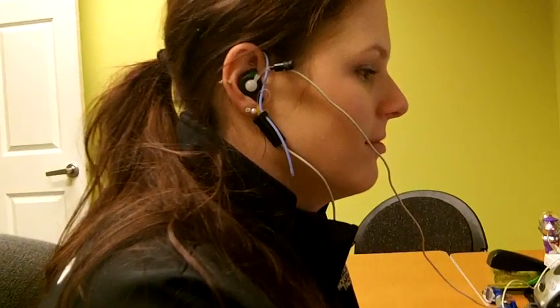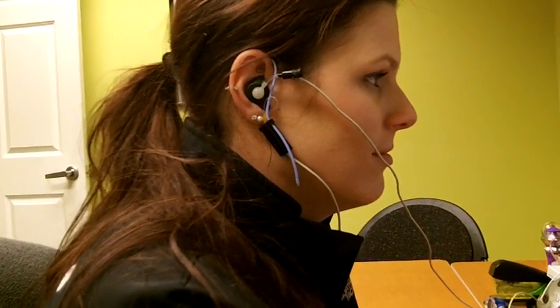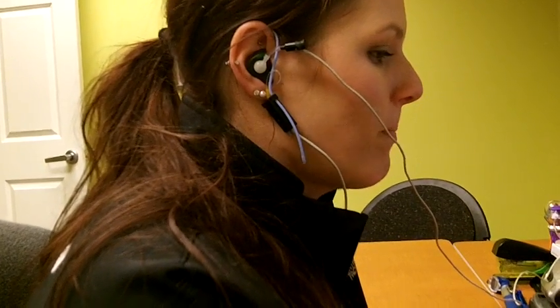Okay, now we're going to show you how to do live Speechmap. So you have just measured your real ear to coupler difference, and that allows the Verifit to create accurate targets for amplification for your patient.